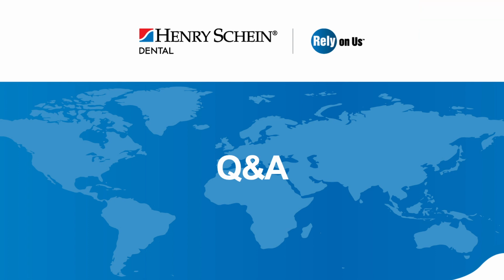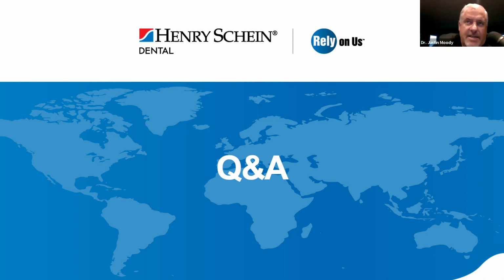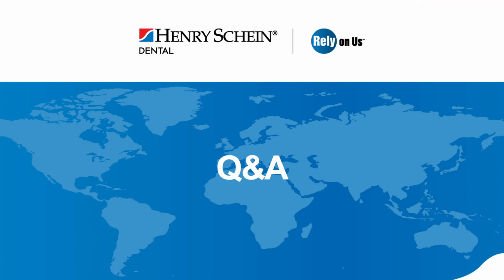Great. Then we've got one more question asking if the Acteon can scan dentures. So you can scan dentures to make an edentulous surgical guide, which is called a dual scan protocol. But to scan a denture and to recreate it, I'm not familiar with that, so I can't speak to that. Looks like we've got an Acteon rep on that's saying yes, it can scan dentures, impressions, or stone models. Perfect. It's just not in my workflow.